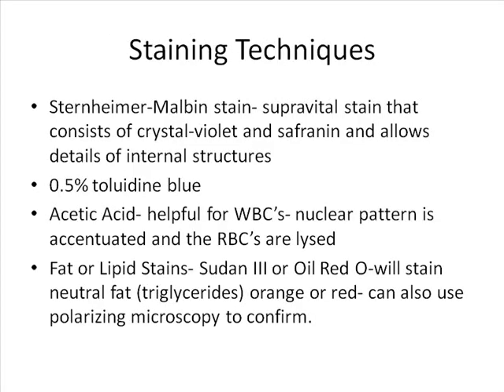So you should remember, you should centrifuge 10 to 12 mLs. You should have 0.5 to 1 ml left, and then use the calibrated slide, which gives you about 100 microliters, I think, that goes into each one of those little slides.